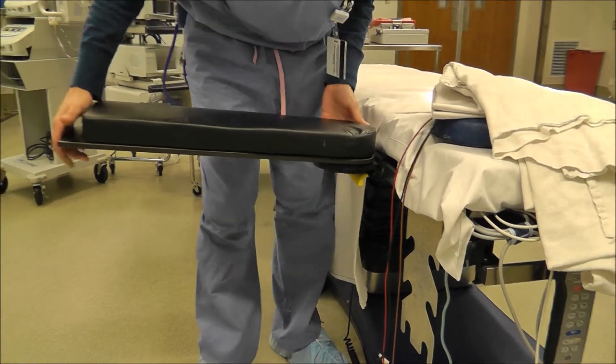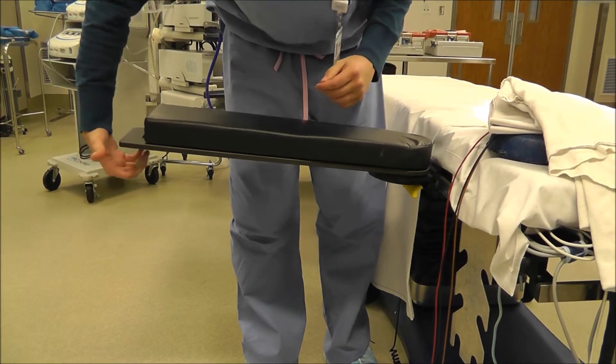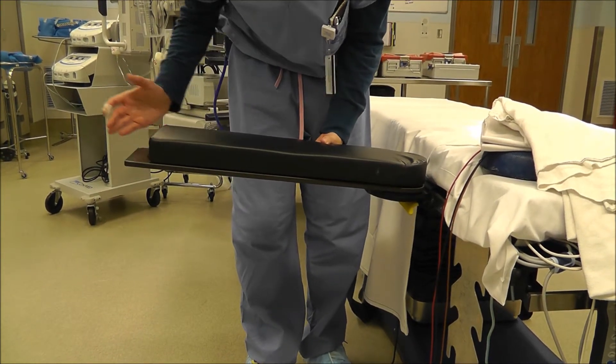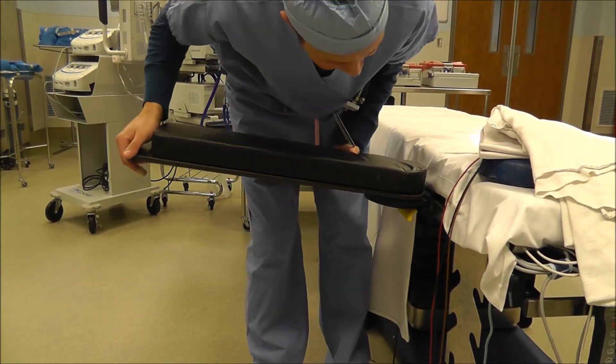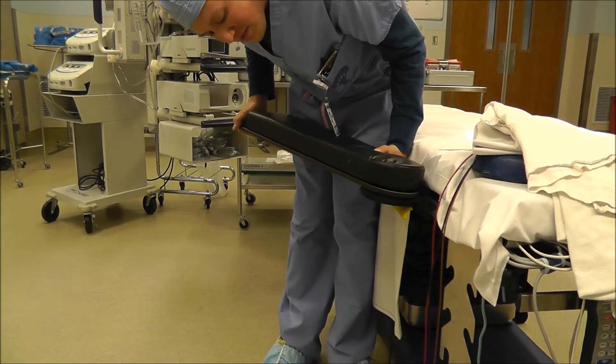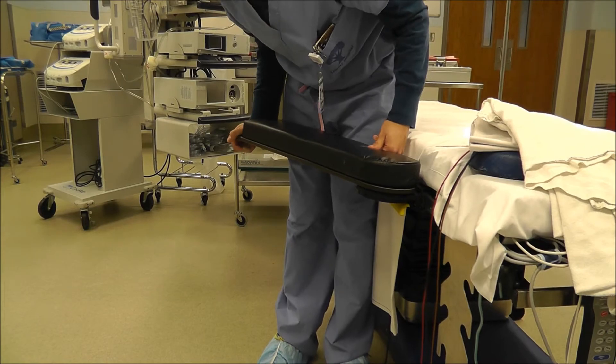Lastly with this one, usually there's another lever down here that you pull to make the arm board go up. But this one you just kind of lift up without pulling the lever, and there's little grooves that it'll sit in. And when there's weight on it, it won't move.